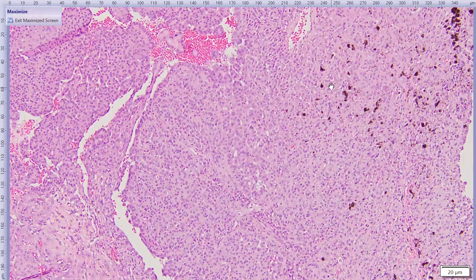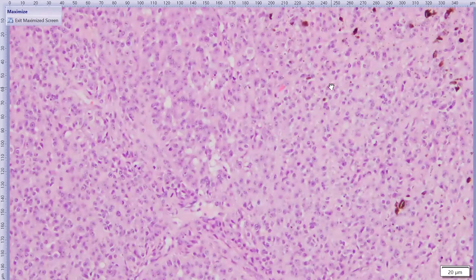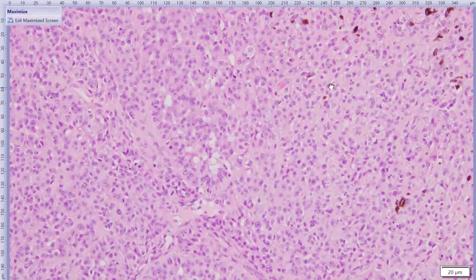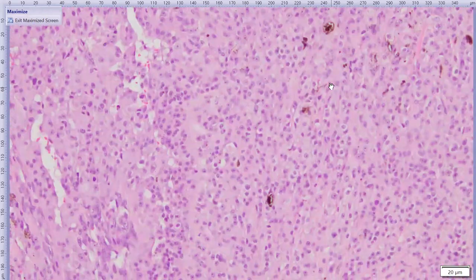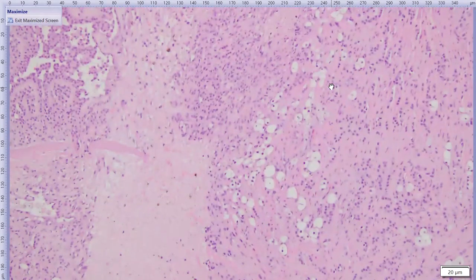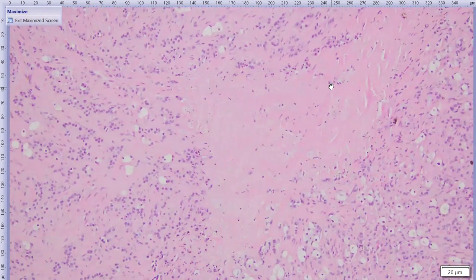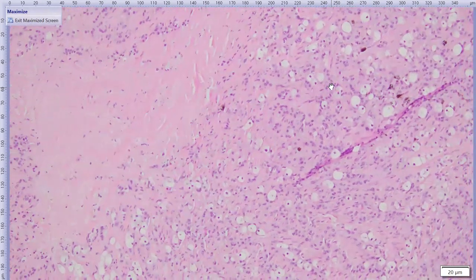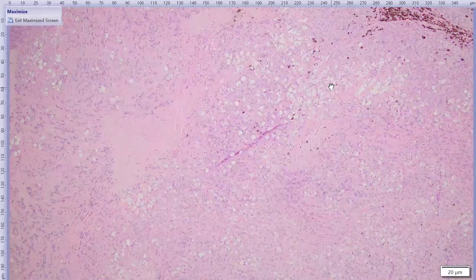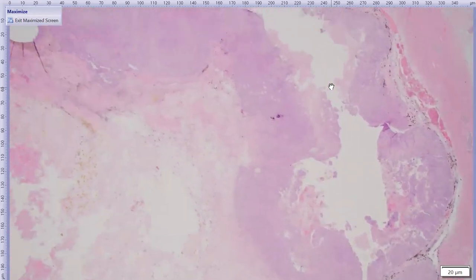So again, kind of lobules and little cords and acini, these neoplastic cells, with eosinophilic cytoplasm. As we scroll around, we can get some variation here. We get some that look a lot more vacuolated, and some areas where there's necrosis and a little bit of collagen deposition being made. So it starts to get a little bit more pleomorphic. And again, it invades into the ciliary body and through the sclera on this side, comes back through the choroid here, and forms masses in the back of the eye.